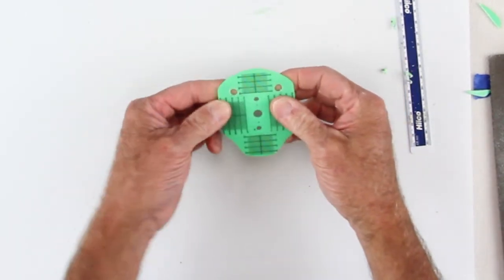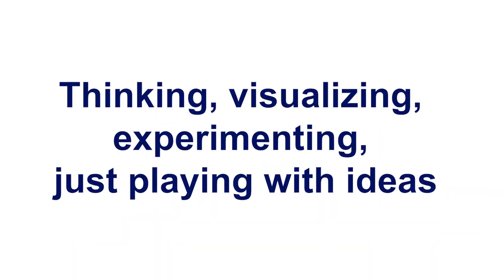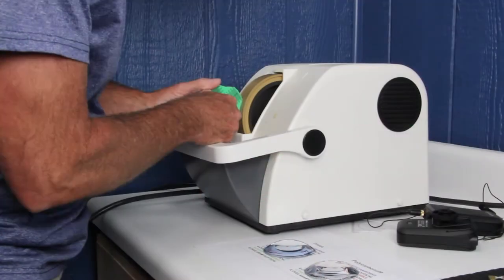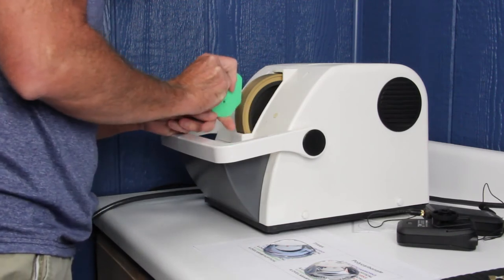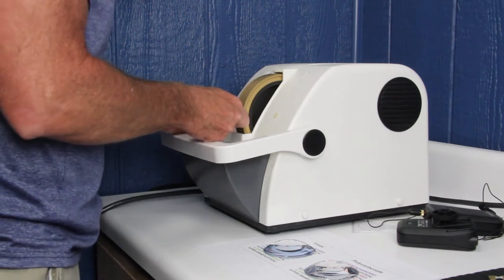So that's about as far as we can go with this at the moment. What I'm going to do, I'll show you in a second, is touch it off on the hand stone so that this is nice and smooth when it hits the edger. I simply know from personal experience and time, having made a lot of patterns in my life, that the smoother the edge of the pattern is, the better results you're going to have.